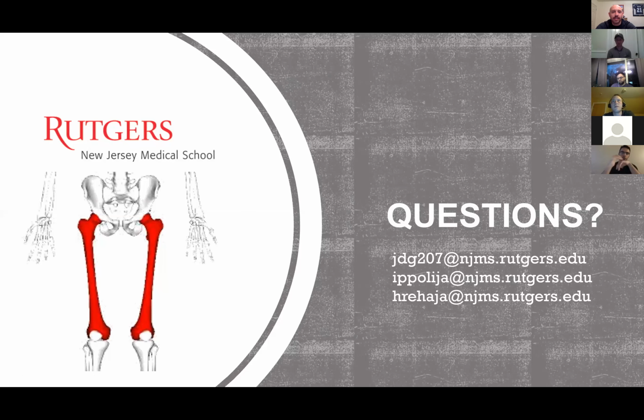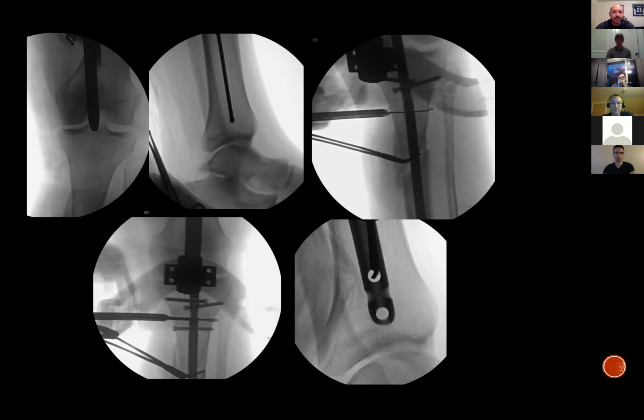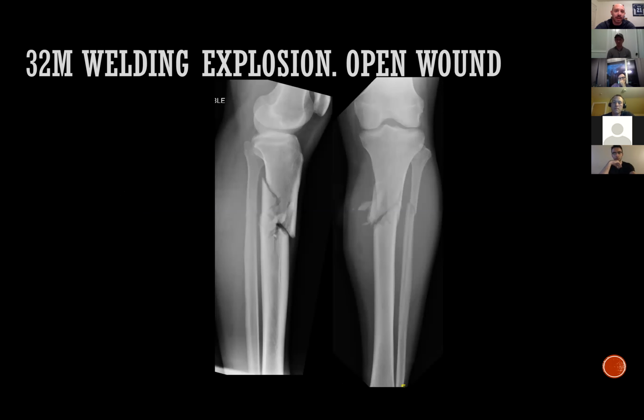So Joe, I noticed in that last tibia fracture, proximally there's multiple lag screws, and distally there's just one interlock screw. And then on some of the femur x-rays, there's one distally, one proximally. Can you explain just briefly why and when you would use multiple distally or proximally, et cetera?